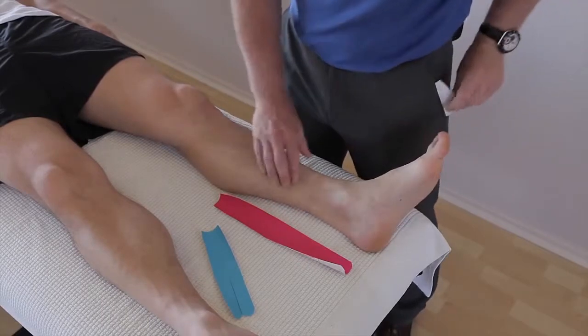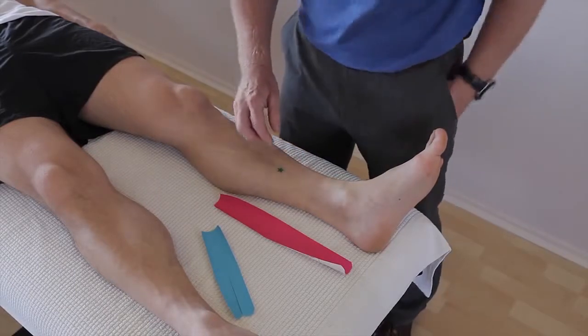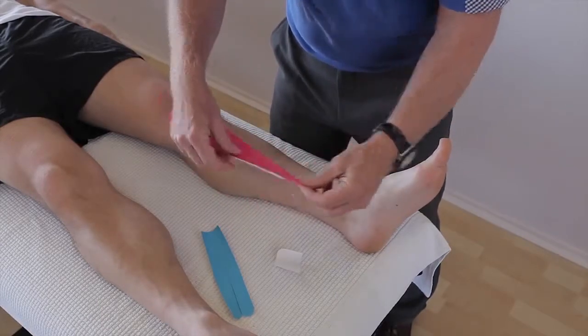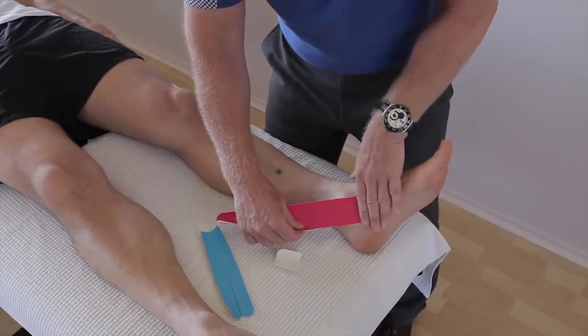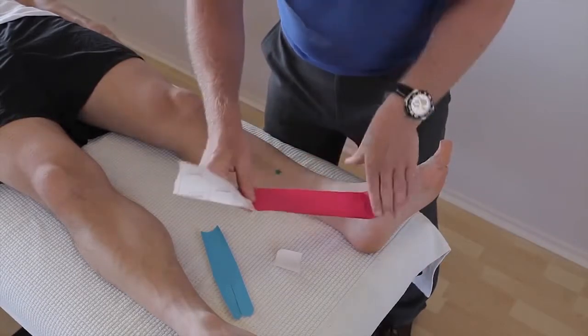So if I just mark roughly where the pain is located, let's say the pain is located just where that sticker is. Turn the tape over and split the first square and apply that onto roughly the navicular tuberosity, and pull it so it breaks the backing. Peel it back to the first square. Use your two fingers, lock it down.